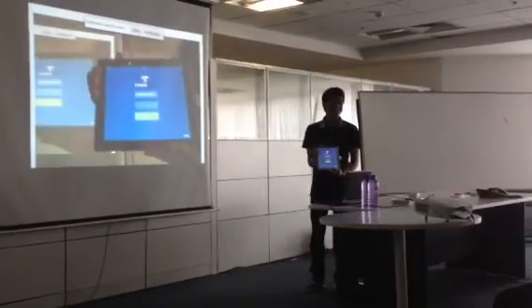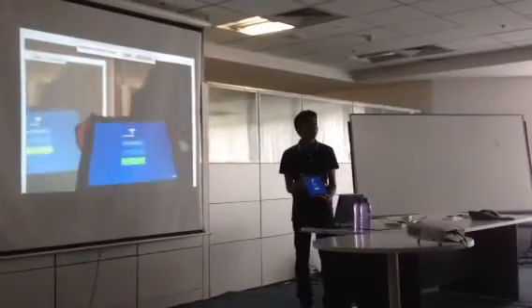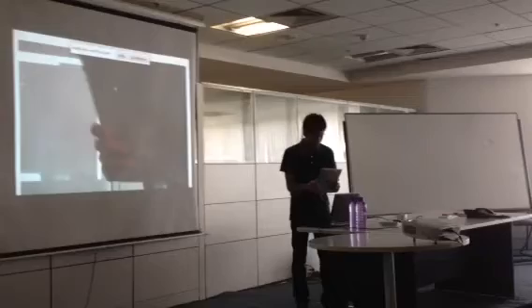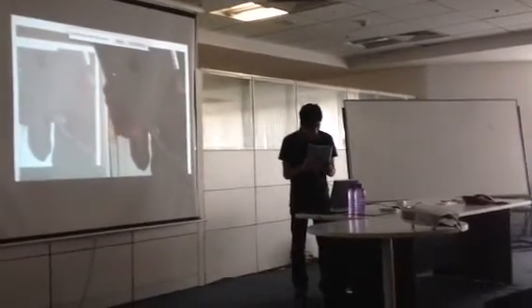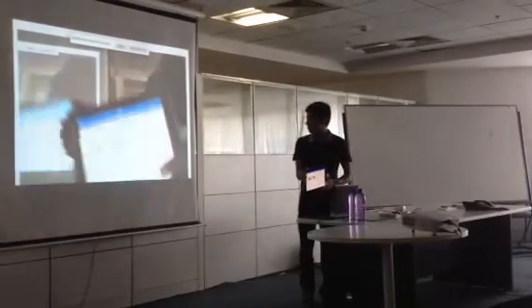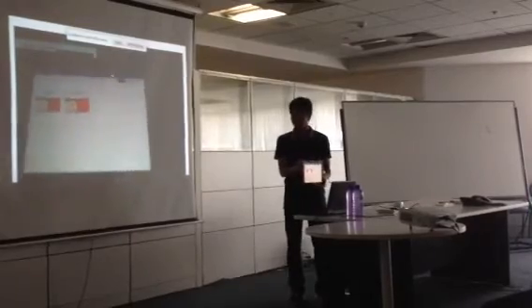Okay, so this is basically the login screen. You log in with the same ID you have as a clinician on the Strandomics website. So I'll go ahead and do that because typing upside down is a bit difficult. And by the way, this is running on 4.14, the demo server. Once you log in, you get this view. This is the patient's view.